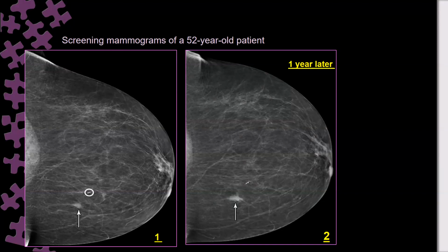Okay, this is from outside. Why from outside? Because it's not present in the second image. Yeah, but this circle is surrounding what? Surrounding a calcification, I think. No. It was not seen in the original image.